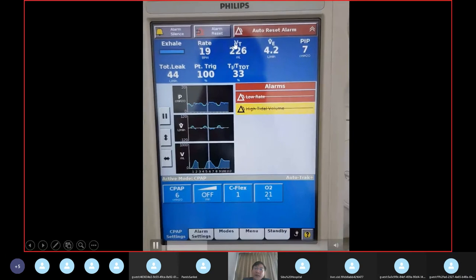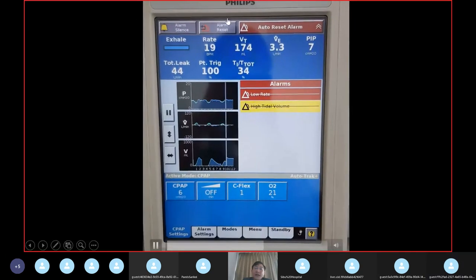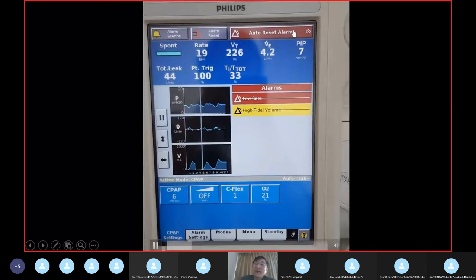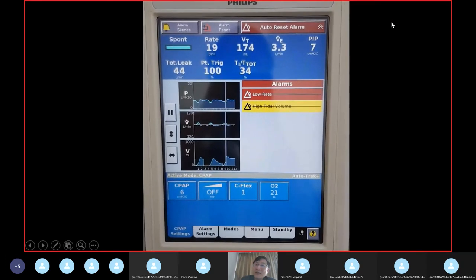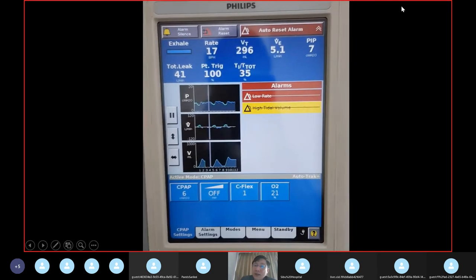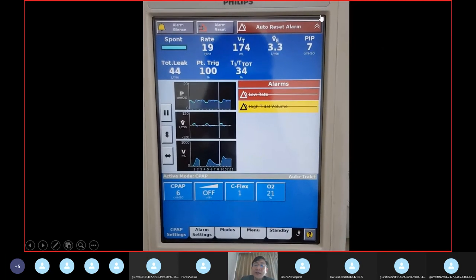So this is the top part of the screen here, all right? There's an alarm silence, alarm reset, and then this is what we call the alarm information that you have here. And over the right corner here, there is also an adjust button. You see that there's a circle thing, and then in the middle there's a tick, right? It's actually a knob for you to adjust the setting later on, okay?